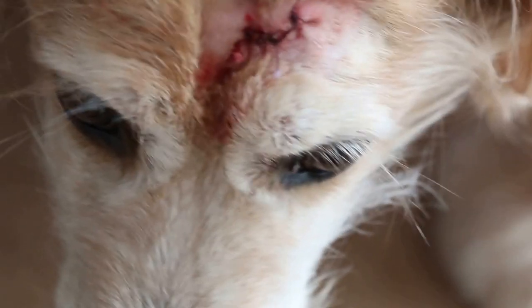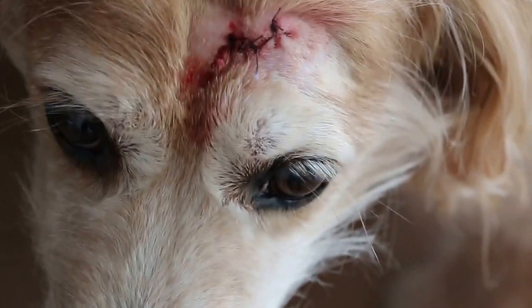The skin is sutured with absorbable 2-0 sutures. Pain killers are actually not necessary, but this one has to keep clean. Keep clean — and no flies.